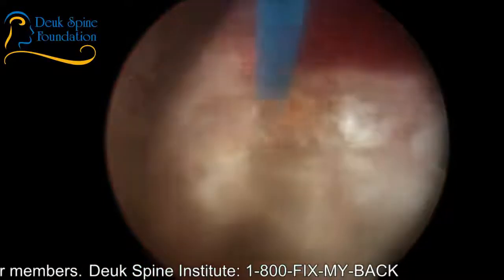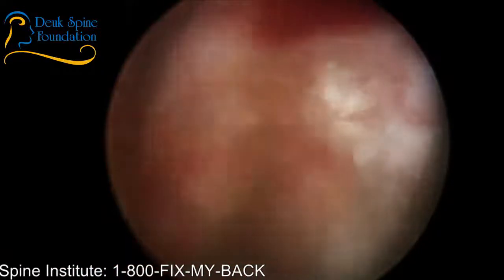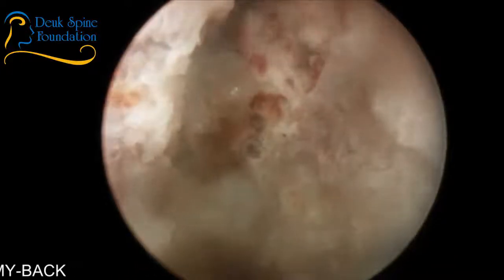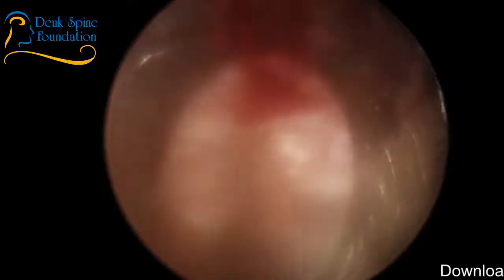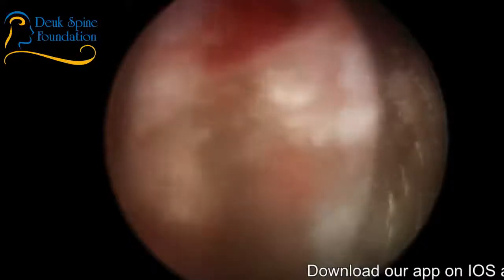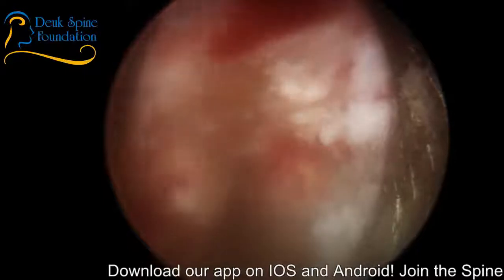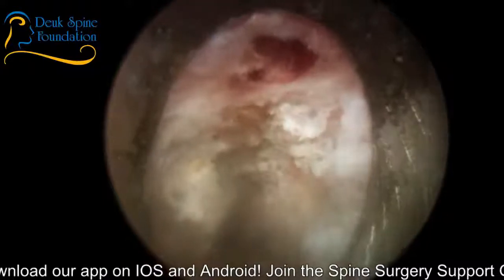So one of my tricks, if I really need to see well, is I'll take the laser out, and if I just want a brief glimpse of what I'm doing in here, I'll put my grabber down. This is very strange. Is that the right grabber? Yes, sir. I know, but I can't get it down. Is there some disc in the end? Feels fine. There we go. I think there was just some bone in there.